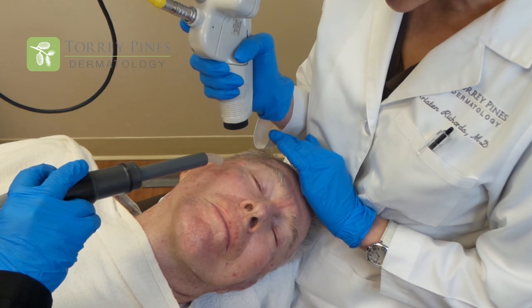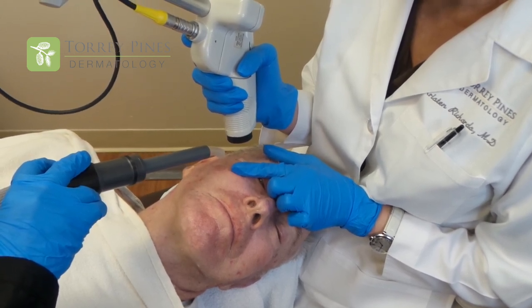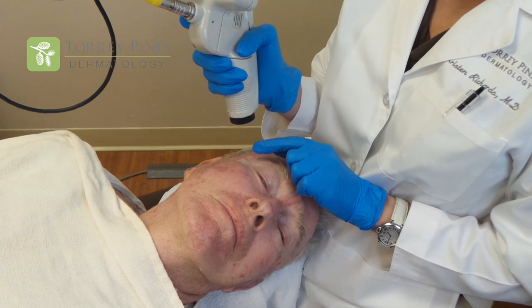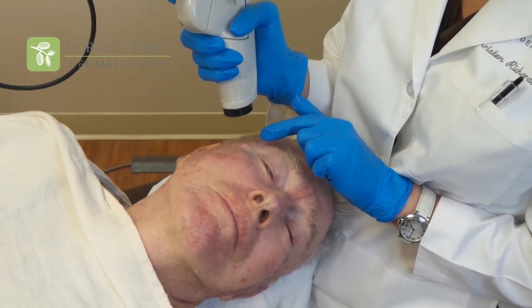The patient felt nothing. If you take a close look, you can see these little tiny white fractionated dots — each little dot is surrounded by the patient's normal skin, and that's what helps the recovery happen so fast. Unlike the old-fashioned CO2 lasers where patients looked like burn victims for three months, this is a very safe laser with a quick recovery on the order of five to seven days of peeling and redness. You don't look great for the first three or four days, but it does not hurt and patients recover very nicely.